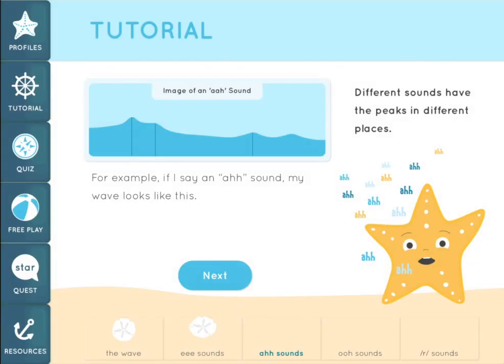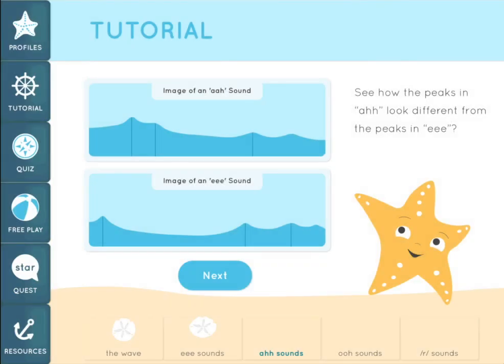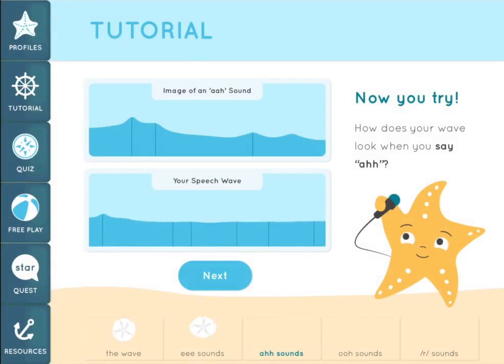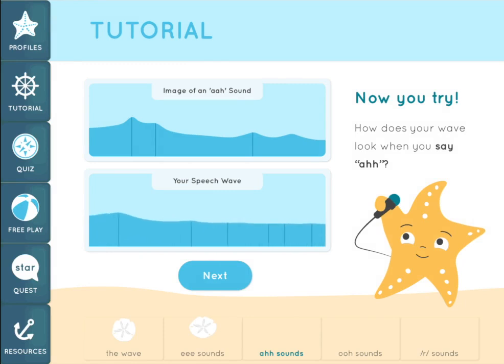All speech sounds have recognizable peak locations along the wave. For example, if I say an AH sound, my wave will look like the picture here. See how the peaks in AH look different from the peaks in EE? Now watch me say AH — you will see the peaks in the wave on the bottom line up with the peaks in the picture of a wave on the top. AH.